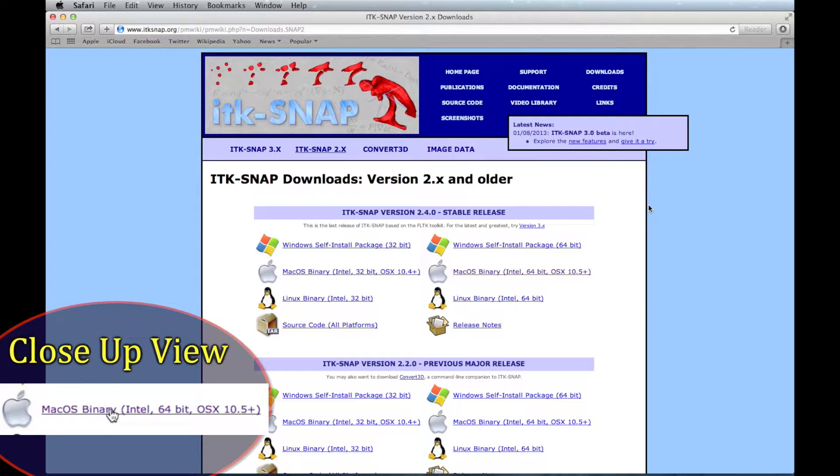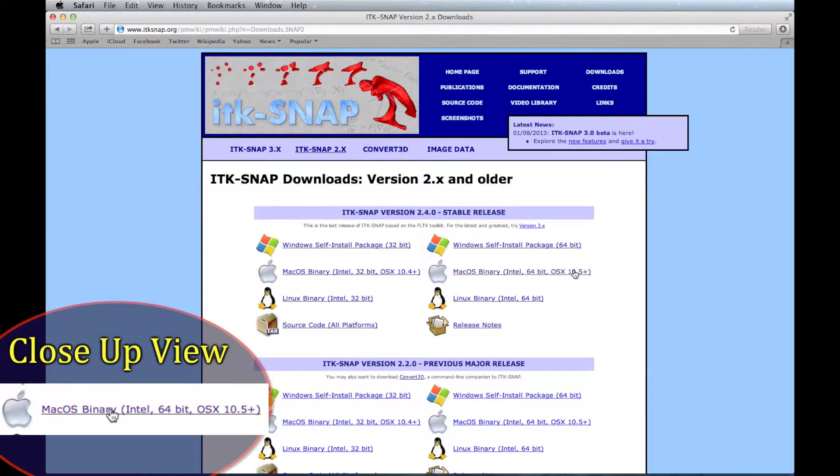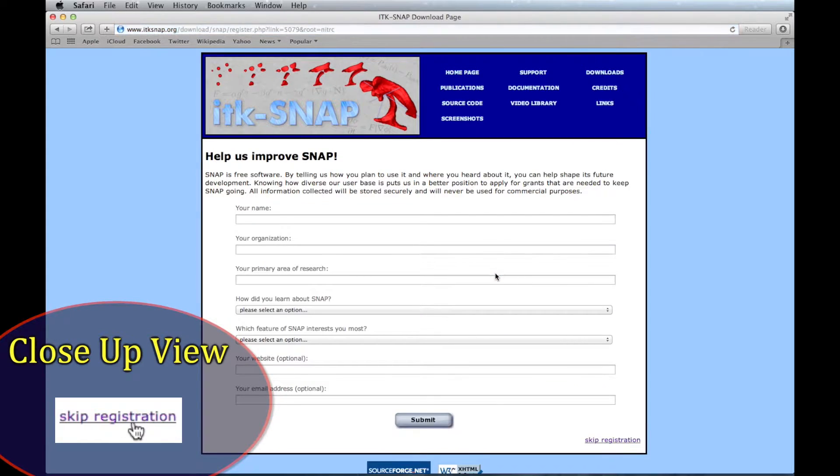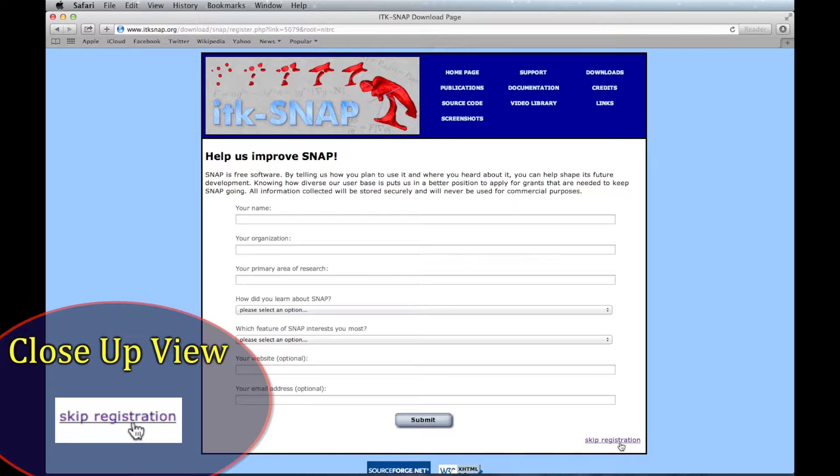Locate your operating system and click to download. You can help improve this software by providing some information or you can skip the registration and go directly to the download.